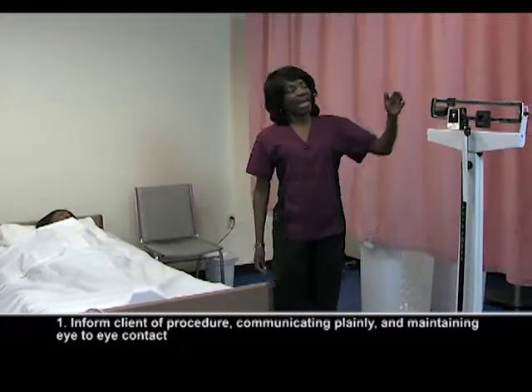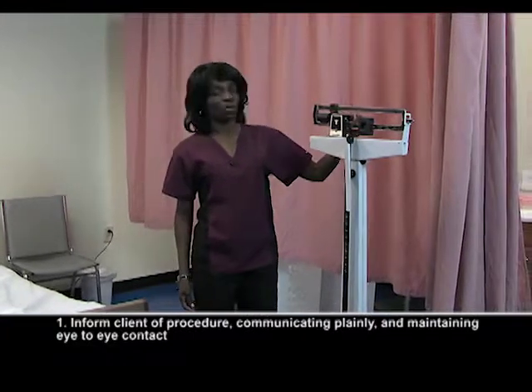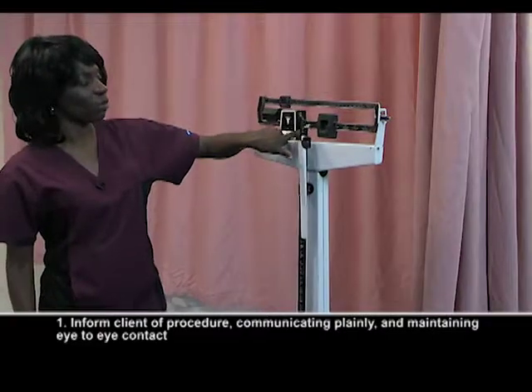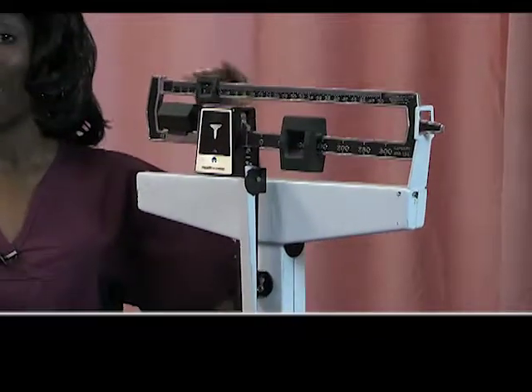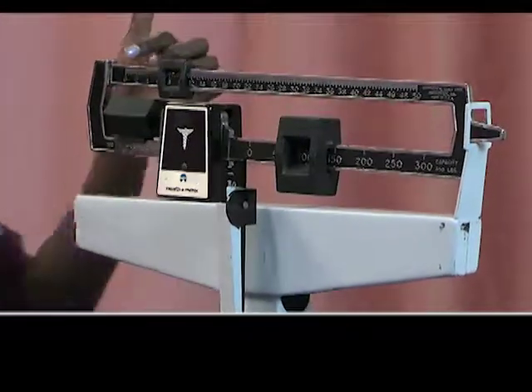One thing you want to remember and really understand is how to actually record a weight when you're using a stand-up scale. Down here at the bottom you have your base weight, 0 to 300. You're going to add that to your top weight up here, which goes from 0 to 50. The even numbers are on here for you; however, the odd numbers are not. So you want to make sure that you're able to read this. It starts off with 0.